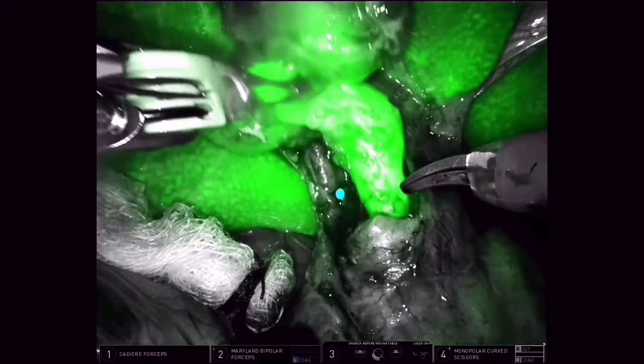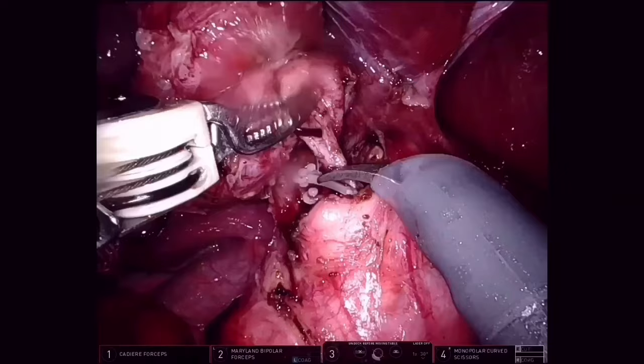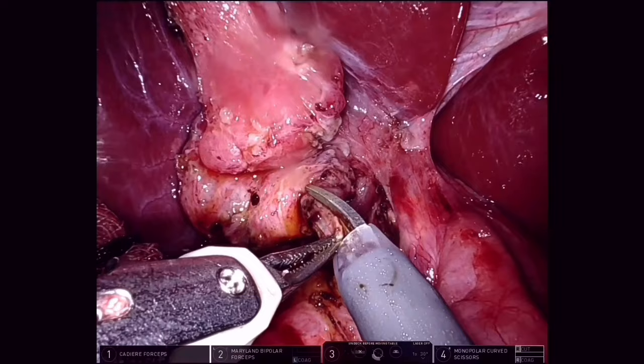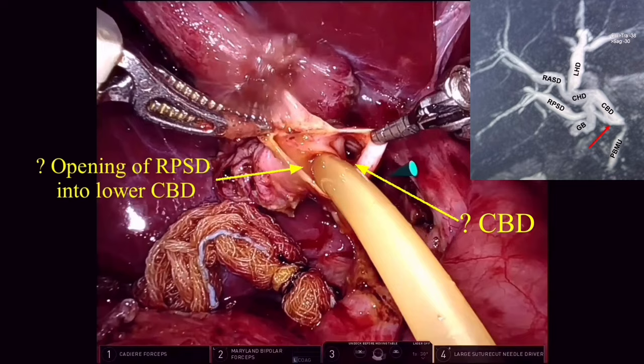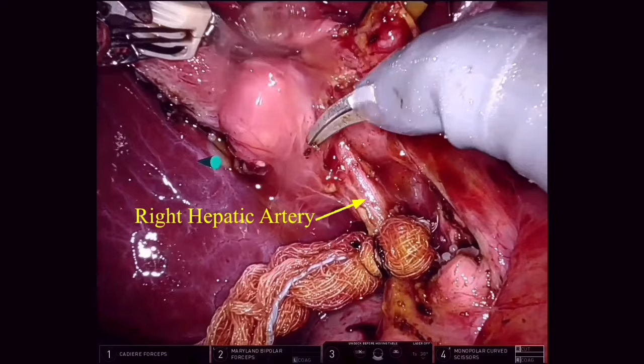The CBD is dissected well into the pancreatic crater till it tapers. It is doubly clipped and divided. We then slit the distal part of the CBD and see two openings: one corresponding to the CBD and another corresponding to the aberrant duct joining the distal CBD. We cannulate the aberrant opening with a Foley's catheter and fix it with a suture.